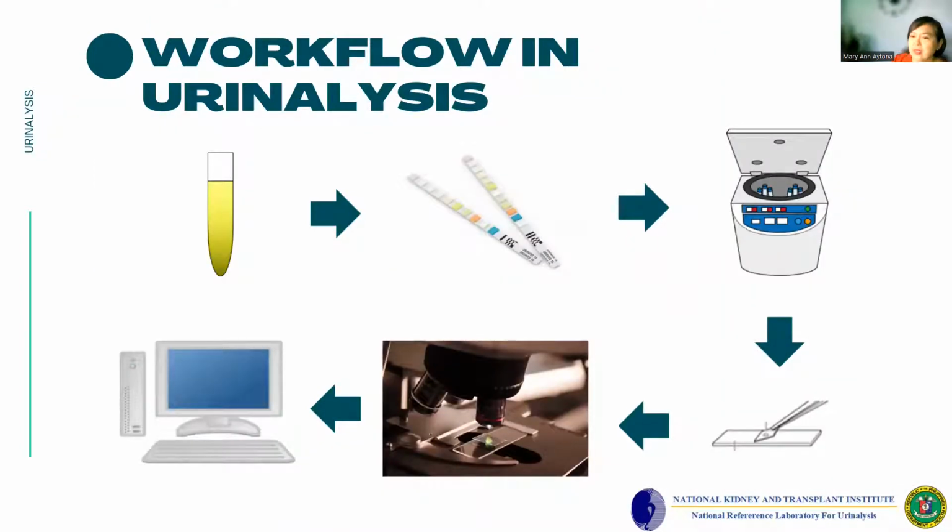In a traditional urinalysis, we aliquot at least 10 ml sample, do gross observation by checking the color, turbidity, or transparency, the urine-specific gravity, then dip one stick into well-mixed and uncentrifuged urine sample. Then we check one by one the test strip parameters and manually write all results in our request form.